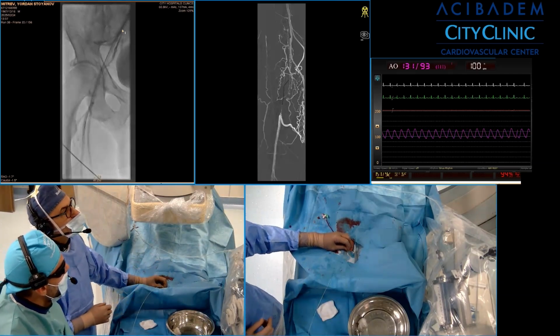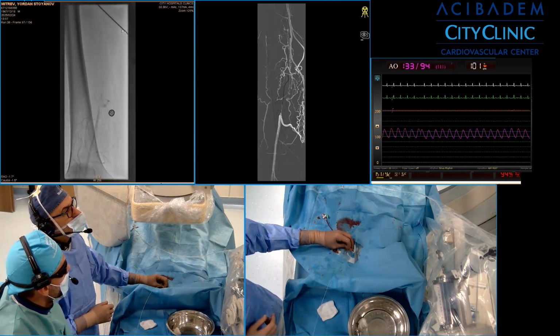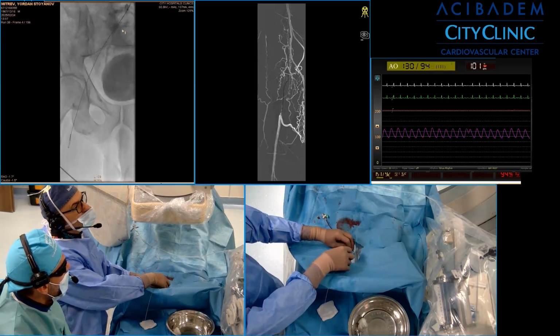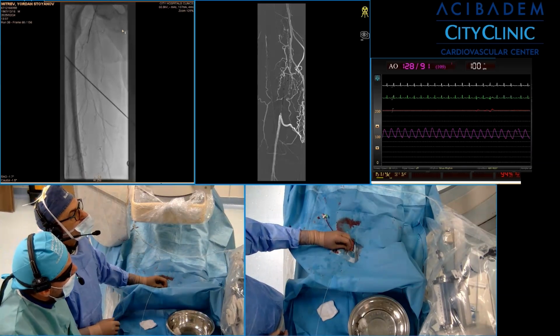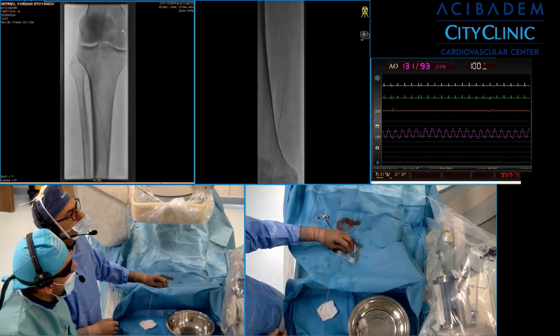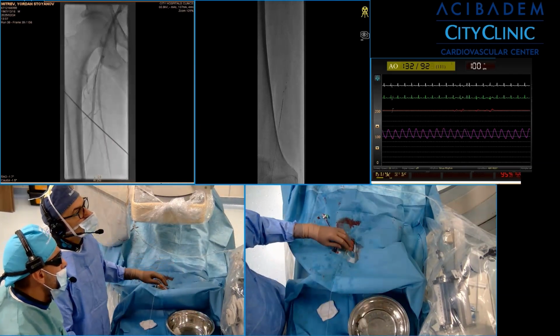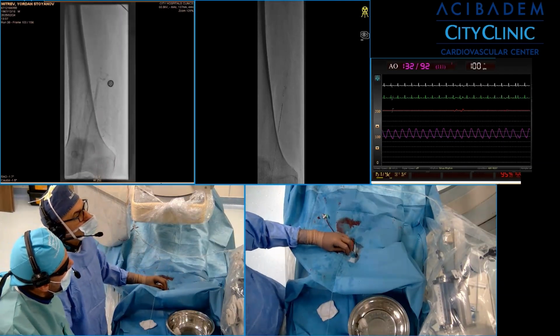Roadmap. We did a roadmap. It's probable that we are still subintimal, unfortunately, in this part with calcium. Remove the roadmap for the second try, like I had commented already. The huge collateral at the place of the distal and proximal cap is one of the predictors, unfortunately, of going subintimally.